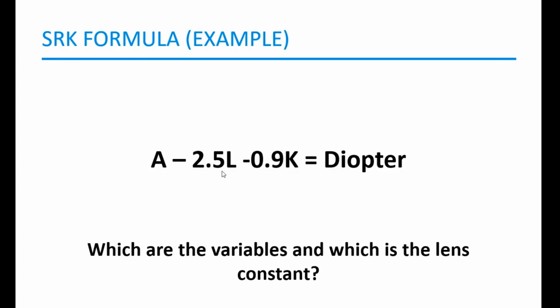But it varies, so it's just a guideline, 2.5 times and up to 3 diopters, because it depends on the eyeball length. The shorter the eyeball, the higher the magnitude of the error. So if you have a very short eyeball, then the measurement error would contribute as much as 3 diopters of IOL power error.